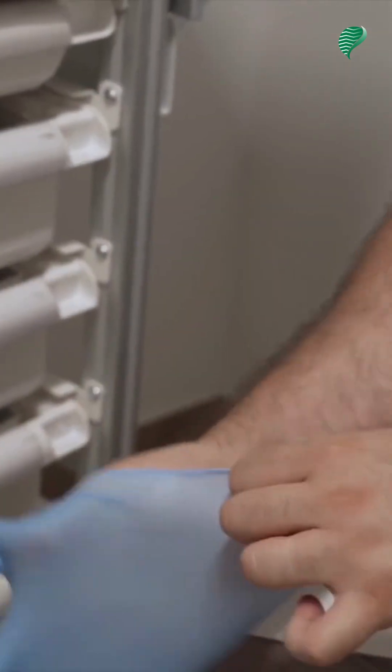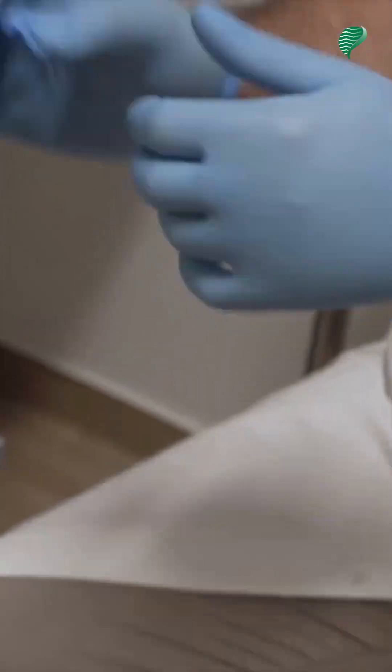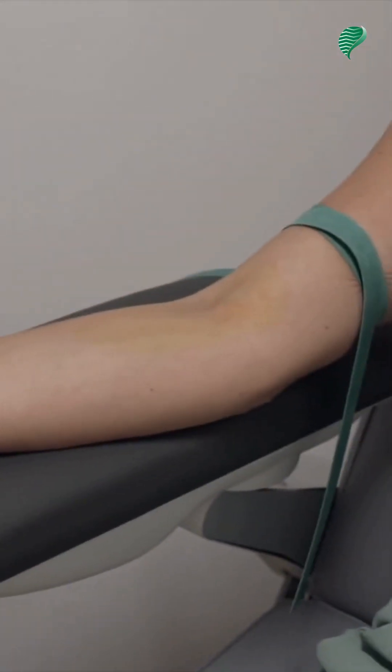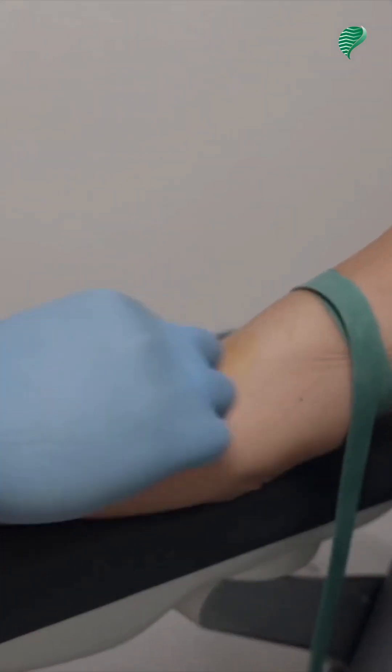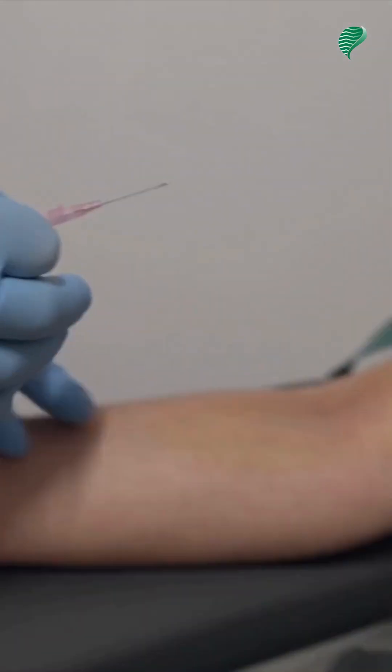Your examination may require an injection of contrast material to improve the quality of the images and highlight certain anatomical structures. For the introduction of the contrast, it will be necessary to insert a catheter. The catheter will be placed just before the exam.